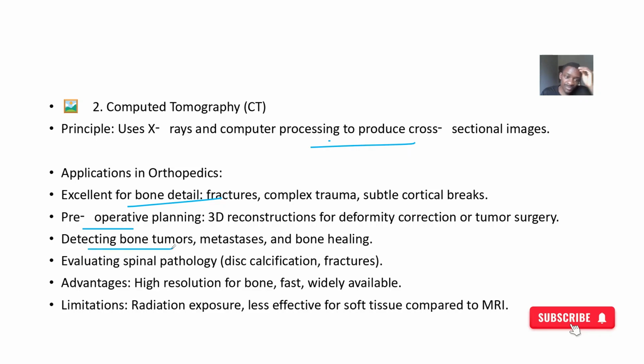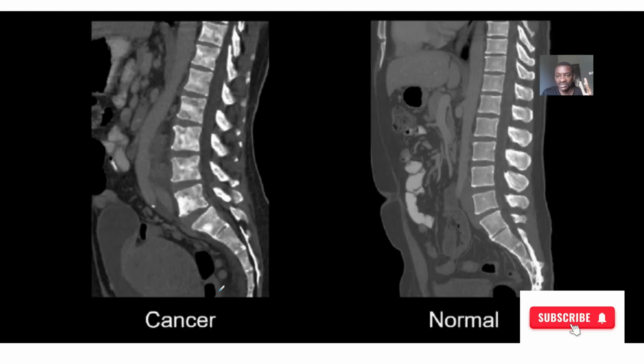It will help you to detect bone tumors, metastases, bone healing. It will evaluate spine issues, disc calcifications, fractures, herniations. So advantages, it gives you a high resolution, very good images for bones, and it's very fast.